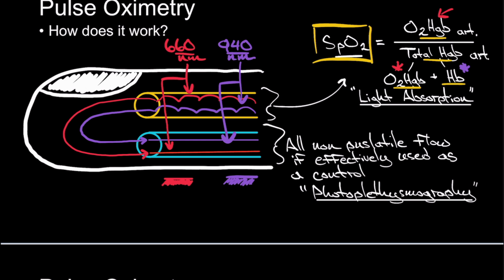There's one caveat to this system that you might get pimped on. So you can see if this is arterial blood flow, this guy right here, I've drawn pulsating waveforms. Both of these, purple and red, are pulsating waveforms. The red demonstrates your oxygenated blood.